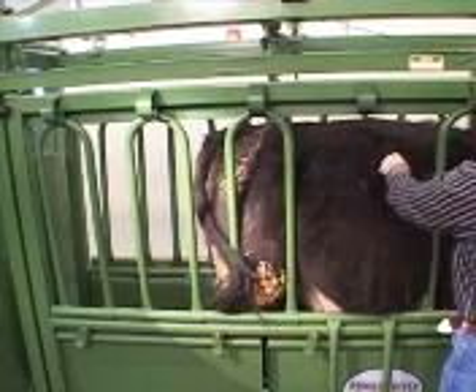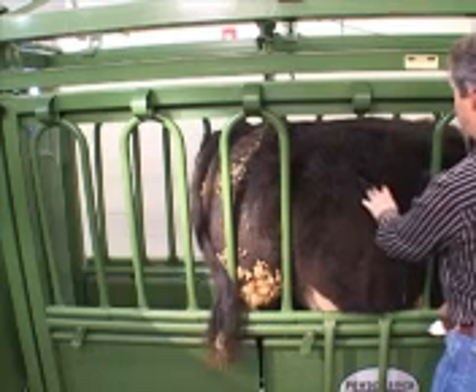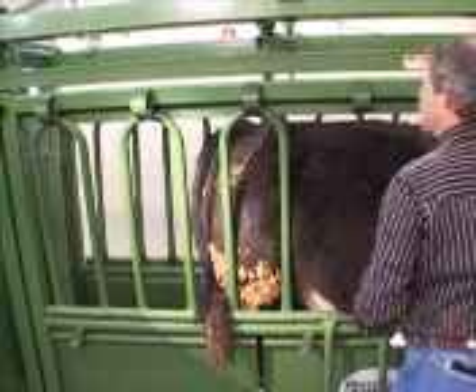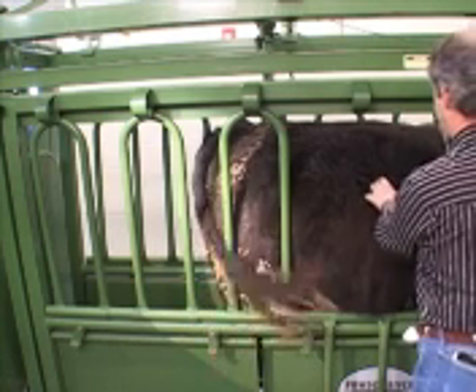That way I can count the ribs without catching that extra rib if they happen to have one. You did get me a fat one, didn't you? And the more obese they are, the more difficult it is as far as being able to count your ribs.